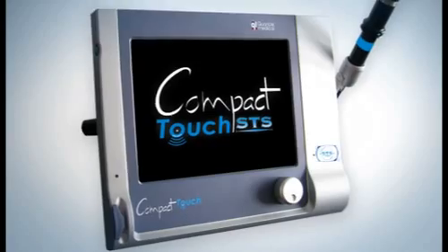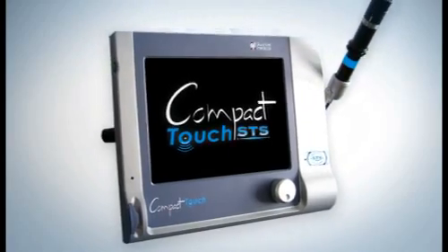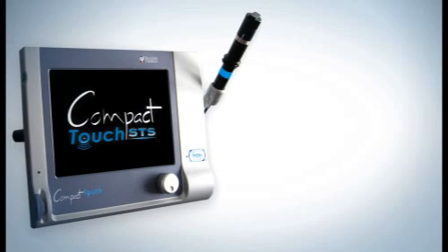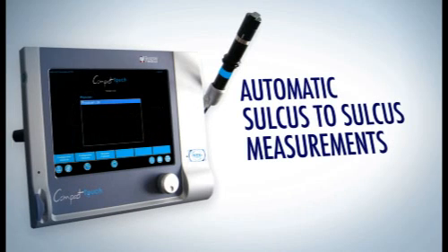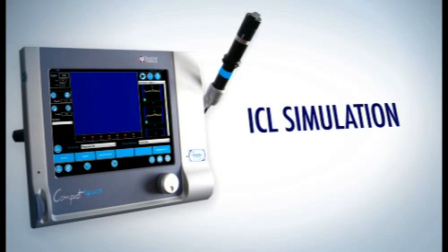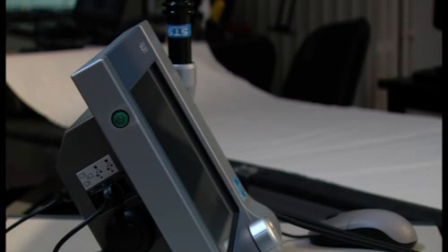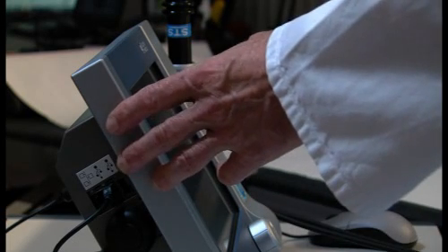The Compact Touch STS has been designed to allow specialists in refractive surgery to take automatic sulcus to sulcus measurements and select the posterior phakic IOL that would be best suited to the patient.